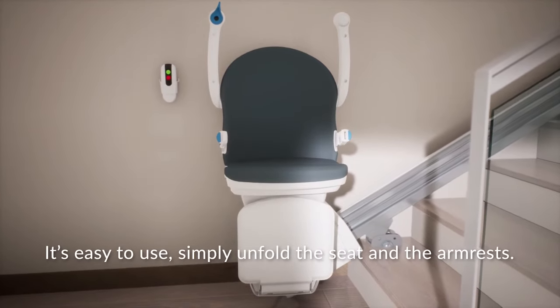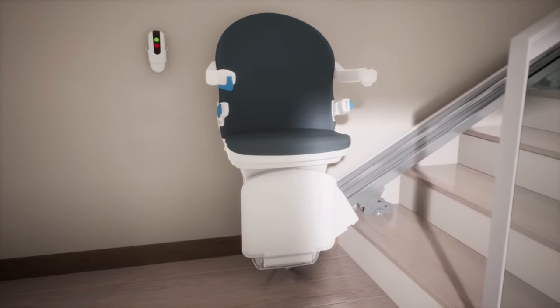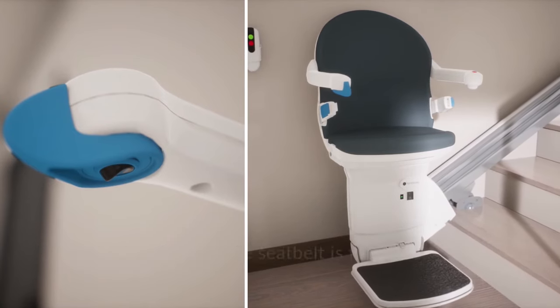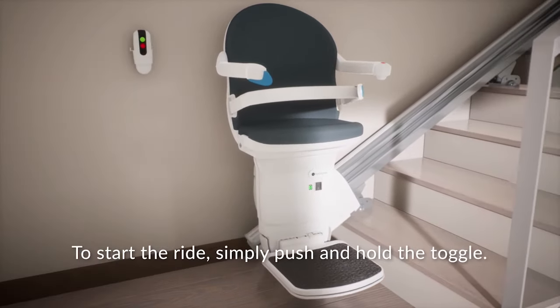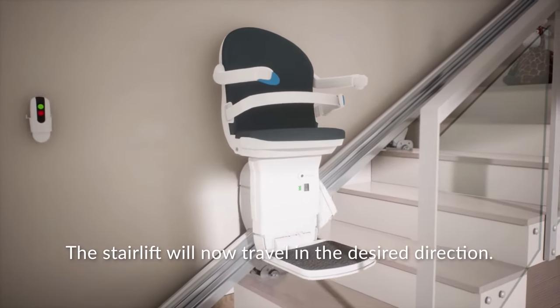It's easy to use. Simply unfold the seat and the arm rests. Take a seat and unfold the foot rest by pushing the button. Make sure the seat belt is fastened. To start the ride, simply push and hold the toggle. The stair lift will now travel in the desired direction.